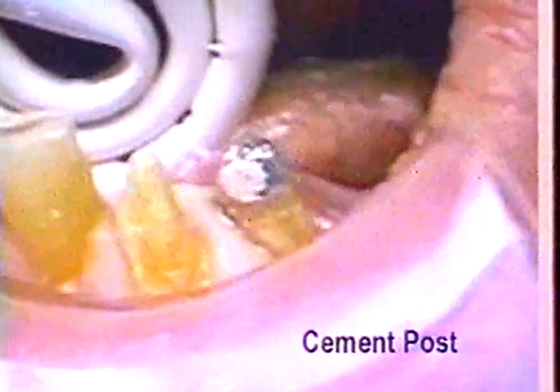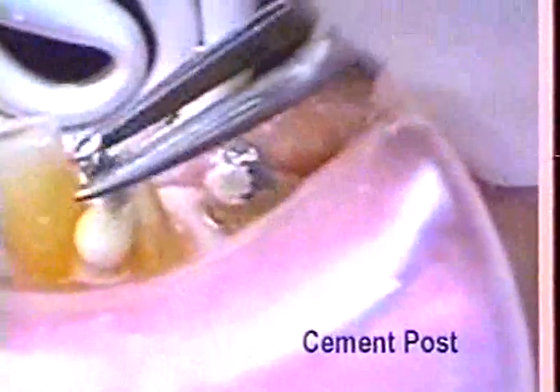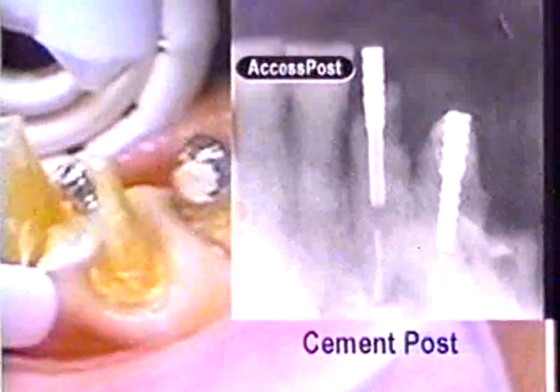The Access Post is coated with cement and placed into the canal. Here we can see the post rising up out of the canal due to the viscosity and hydrostatic pressure of the cement. Pushing the post down again into the canal directs the cement up and into the hollow portion of the post. This relieves the hydrostatic pressure and assures full seating of the Access Post. Next, the excess cement is suctioned away before it sets.